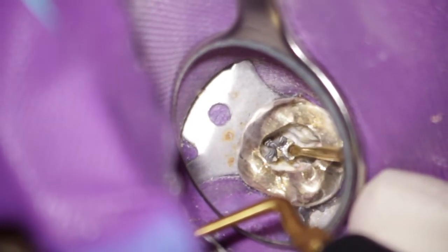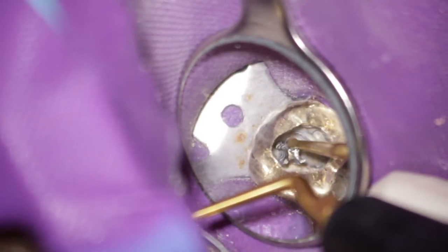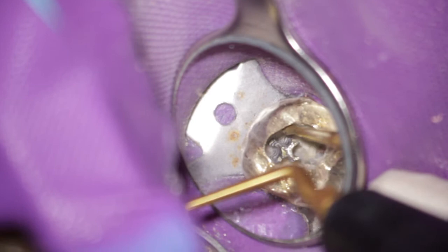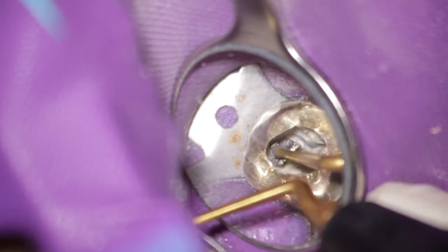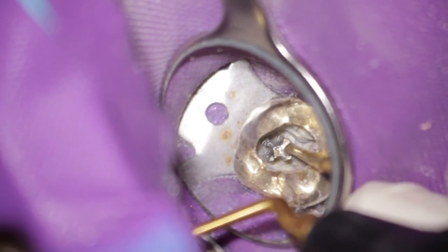You can see how much power it gives to the post head and how the post vibrates. So in this case it is without water cooling to show you the power of this tip, but in a few seconds you will see that we will have the water cooling instead.